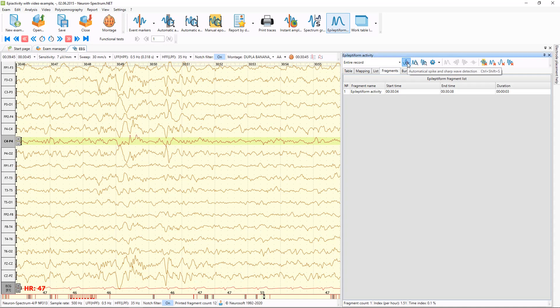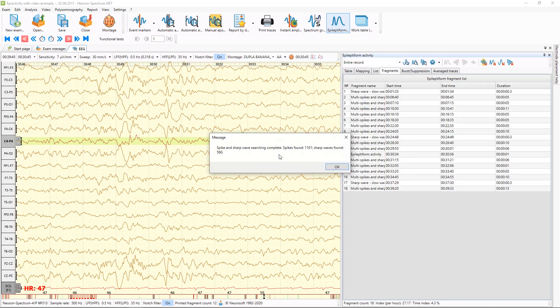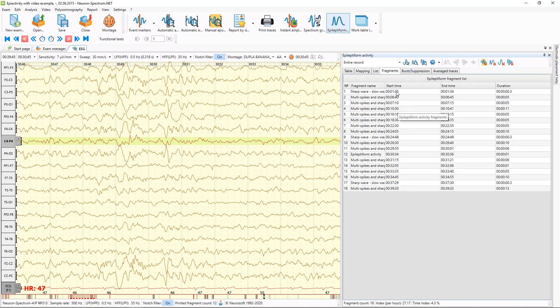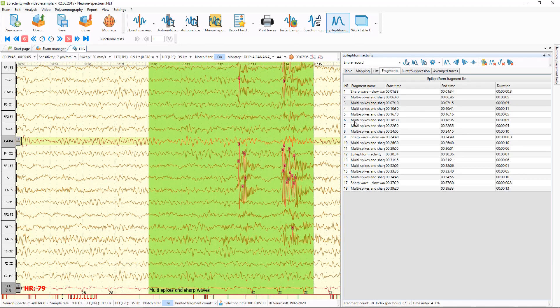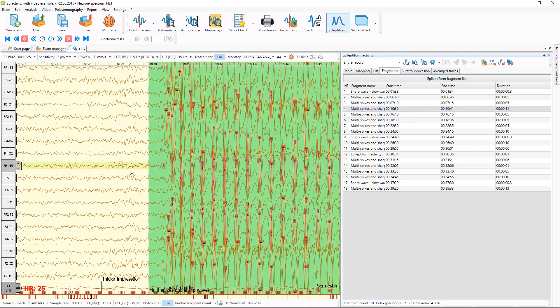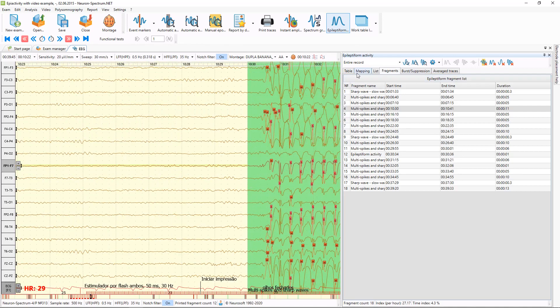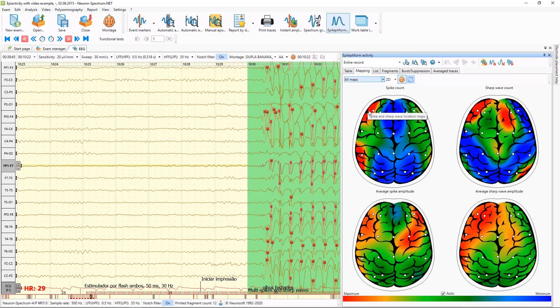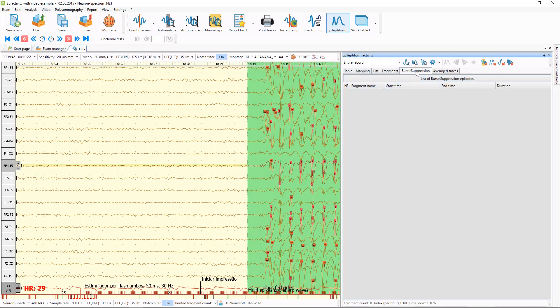Also I can start the automatic spike and sharp waves detector, though it takes quite a bit longer. Here you will also see all episodes marked by this algorithm. On the mapping page you can see spike count and sharp wave count maps, and spike amplitude and sharp wave amplitude maps, as well as average traces for all spikes averaging.